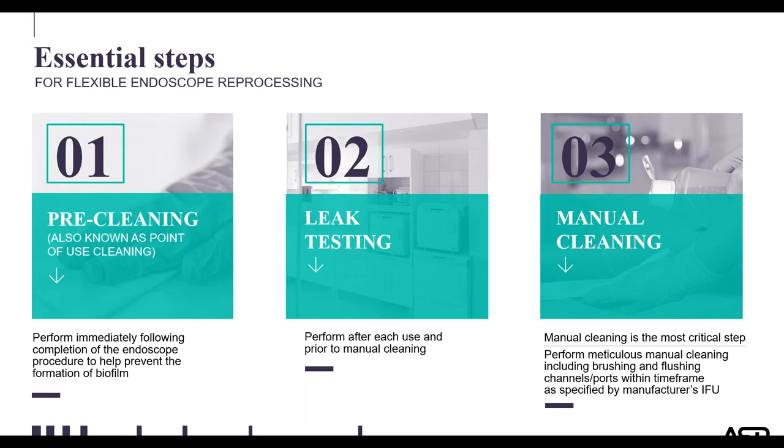This is just an example of one of those small variables that can impact the success of reprocessing a flexible bronchoscope or laryngoscope. And then, of course, if the scope fails the leak test, remove it from service.